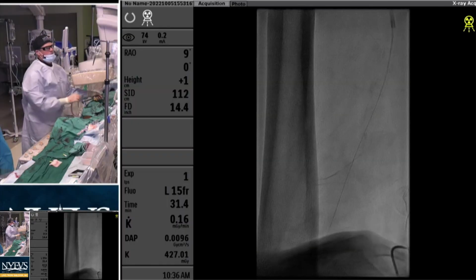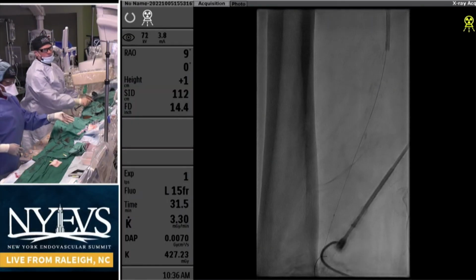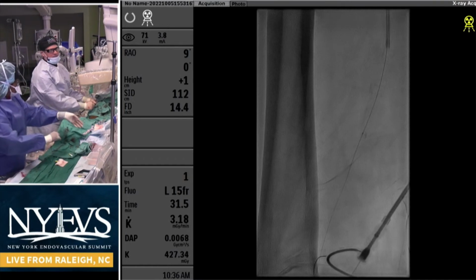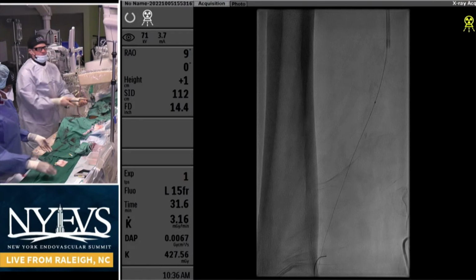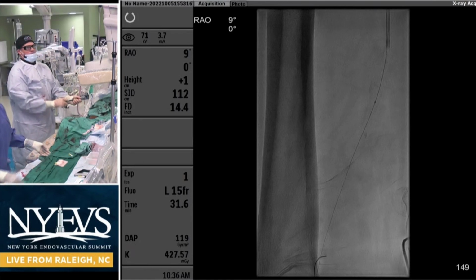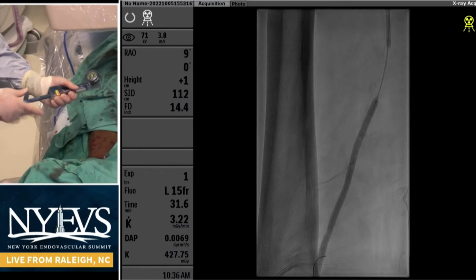All right, George, let's see. I think you break the cap and you look well connected. Yep. So we have. I've got the wire from above down the anterior tibial, and now I've got a 5.0 120 balloon in there, and I'm just opening this up for us.